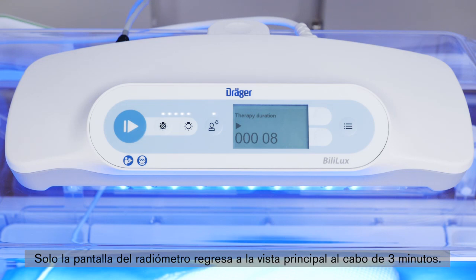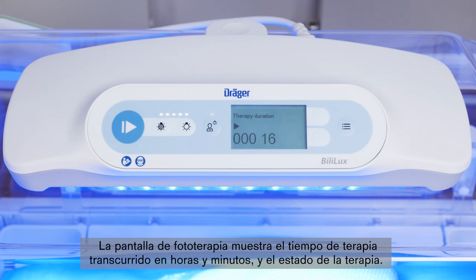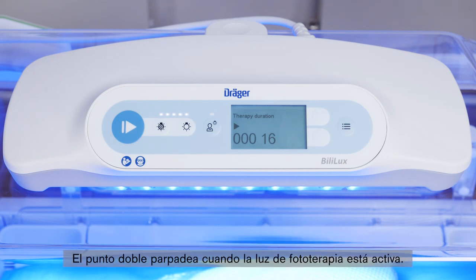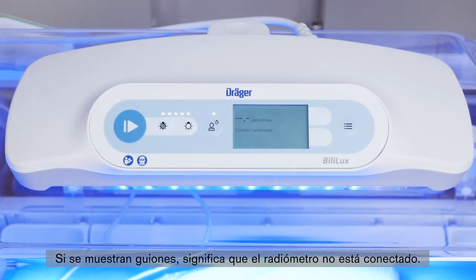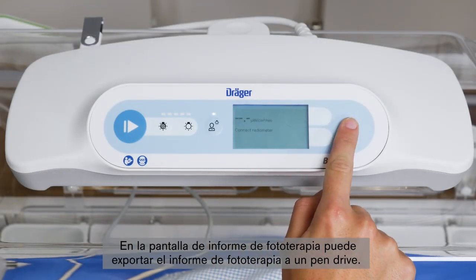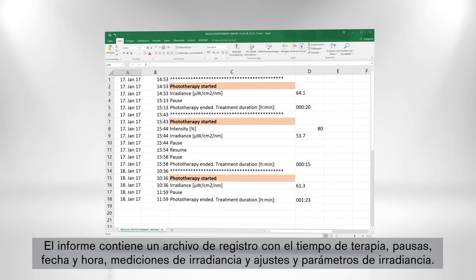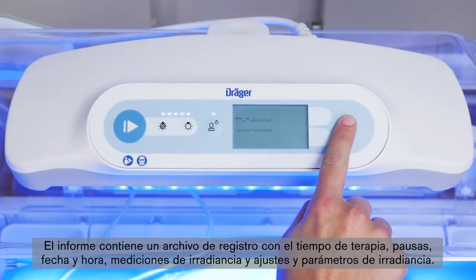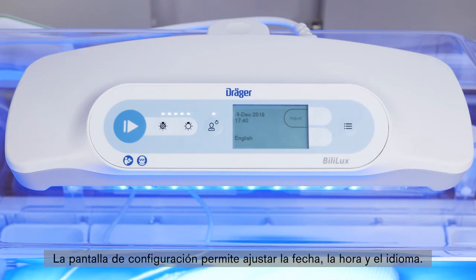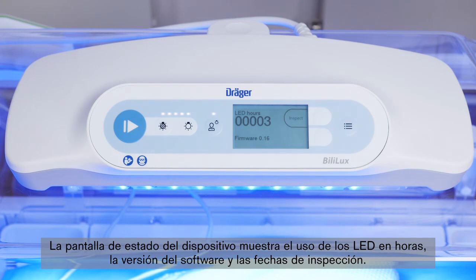Only the radiometer screen reverts back to the main screen after 3 minutes. The phototherapy screen shows the elapsed duration of therapy in hours and minutes, as well as therapy status. The double dot blinks when the phototherapy light is running. The radiometer screen allows the user to view and store irradiance readings measured by the radiometer; if dashes are shown, the radiometer is not connected. On the phototherapy report screen, you can export the phototherapy report to a USB flash drive. The report contains a log file of the therapy duration, pauses, date and time, irradiance measurements, and irradiance settings and adjustments. The configuration screen allows you to adjust date, time, and language. The device status screen displays LED usage in hours, firmware version, and inspection dates.